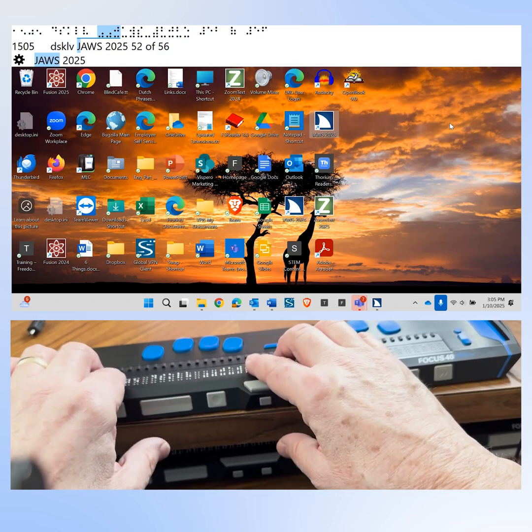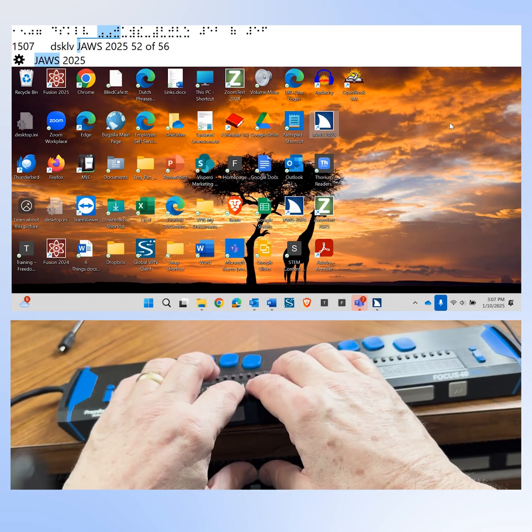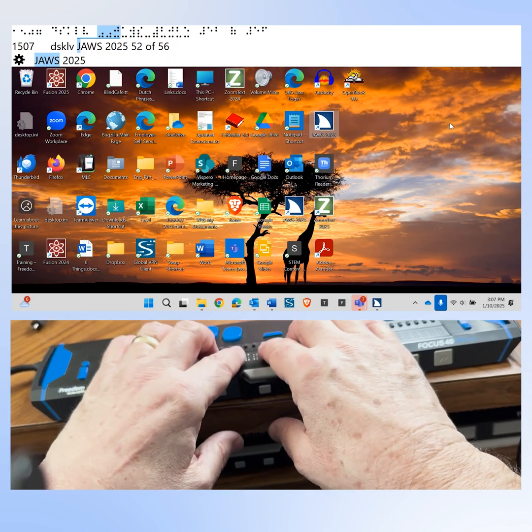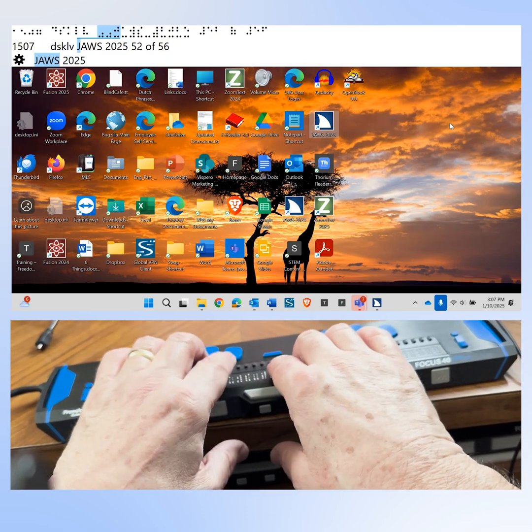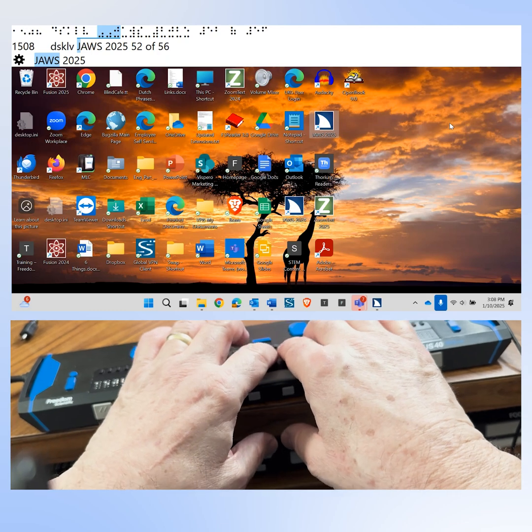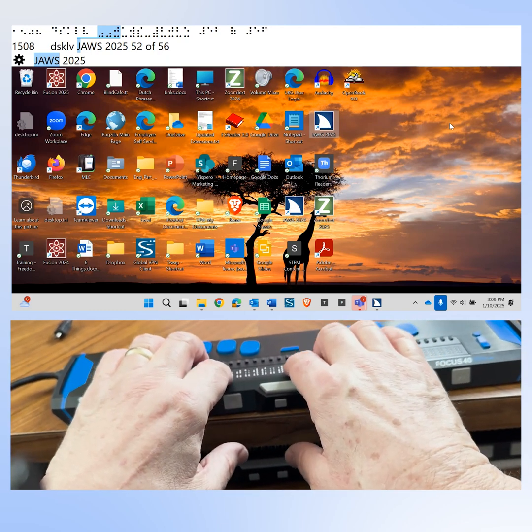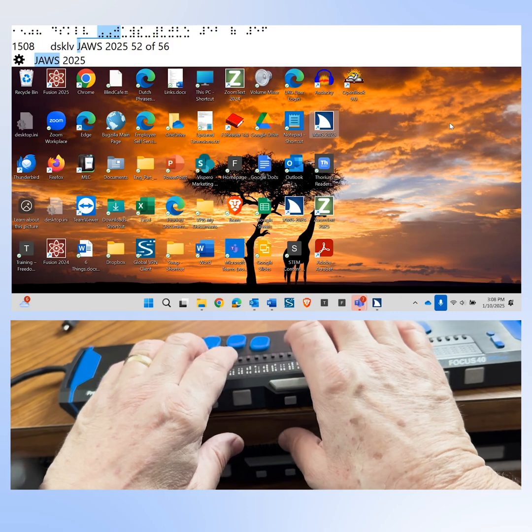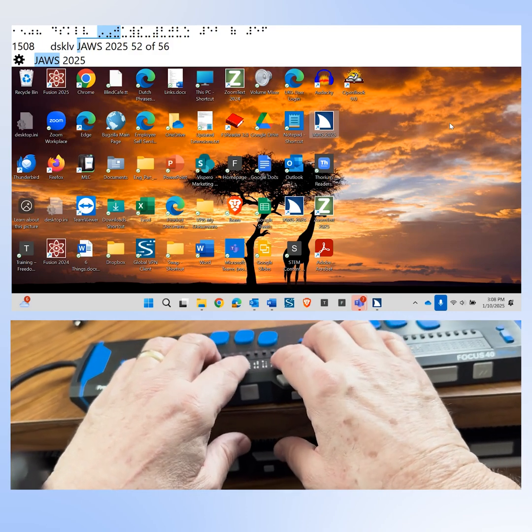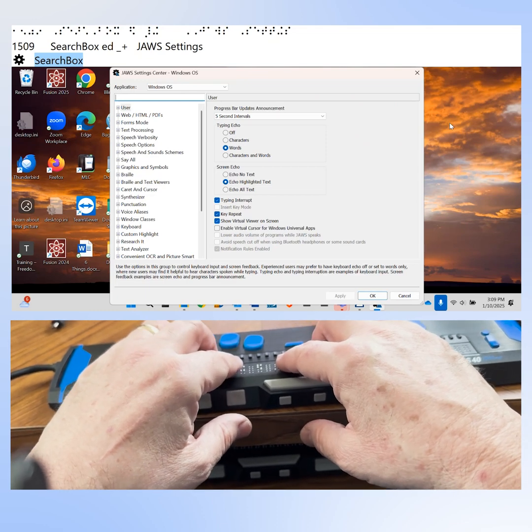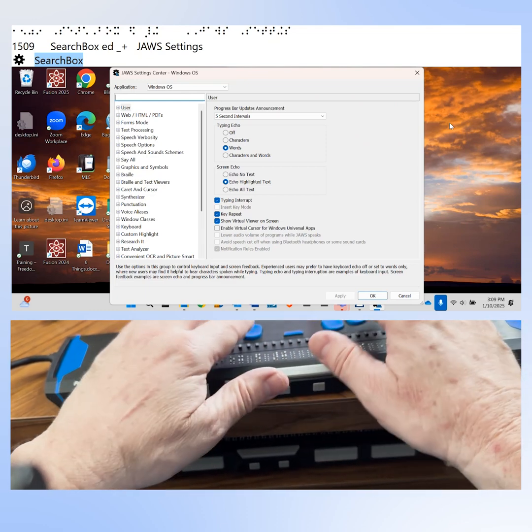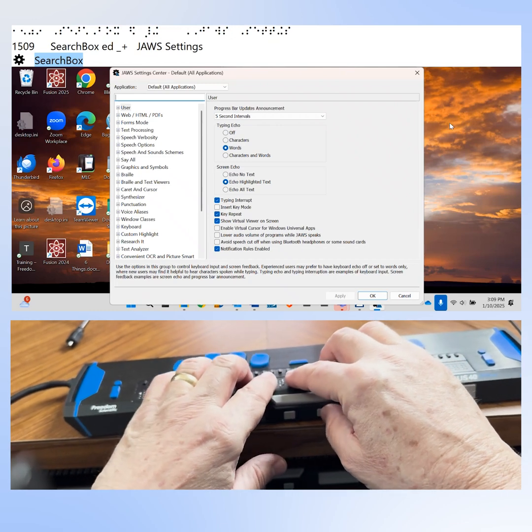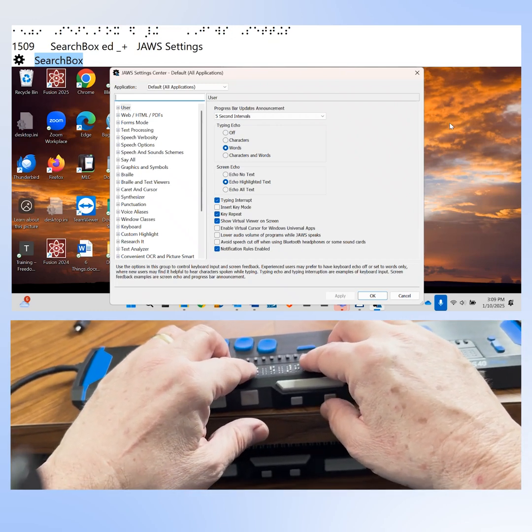Highlighting is the use of dots seven and eight in the braille cell to indicate that text on screen is highlighted. If you look at the virtual braille viewer and the dot patterns display, you'll notice that under "JAWS" and then the number sign 2025, each character has dot seven and eight below it, indicating that item is selected on the desktop. Some people may wish to turn highlighting off. First, configure Settings Center to default settings so changes apply globally by pressing Control Shift D.